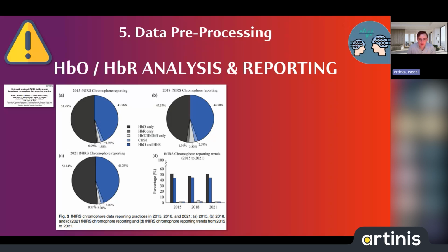And I think what has been happening in the field more recently is that we are asking more and more often to also report the HBR data, to actually also do all the analysis steps that we do with the HBO data also with the HBR data, at least in the supplement. So this is also there and can be looked at.